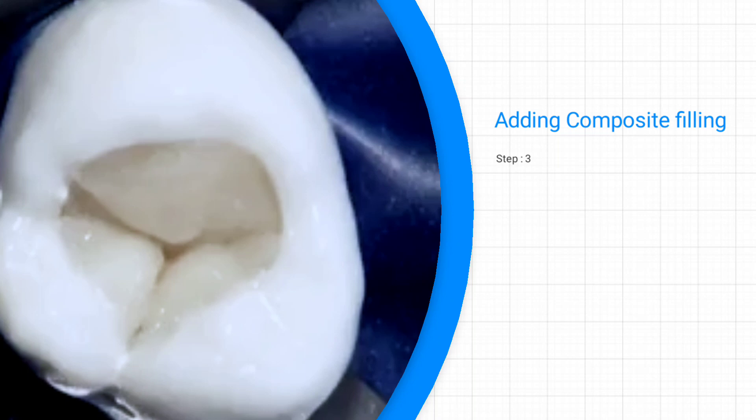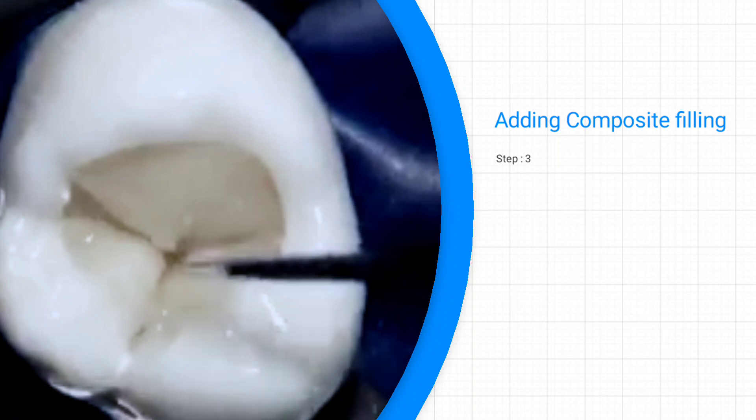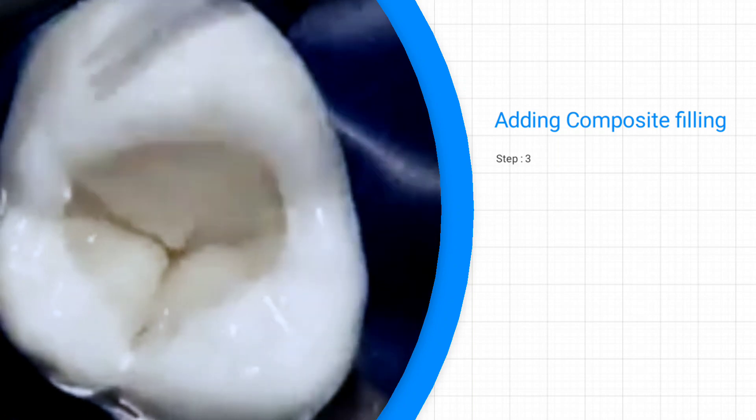Good news is that once this step has been finally completed, moisture control is no longer vital, so you should be able to give the patient a chance to relax the jaws for a moment before proceeding with the finishing of the procedure.